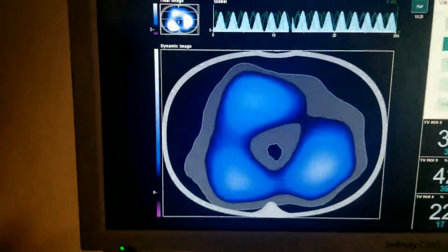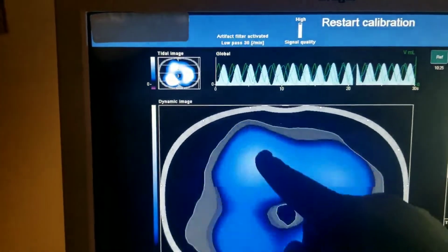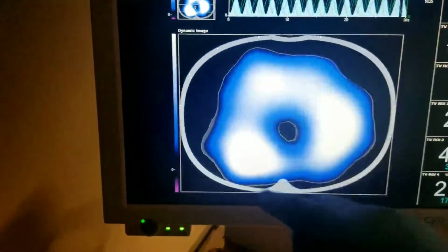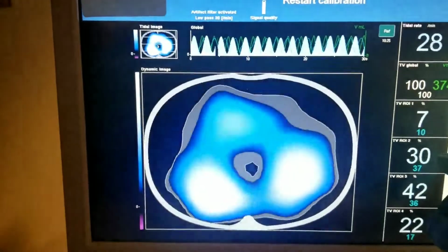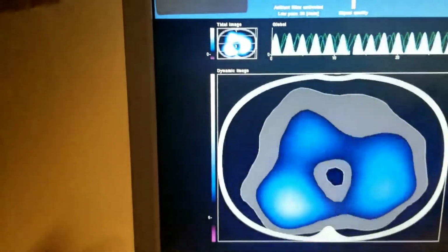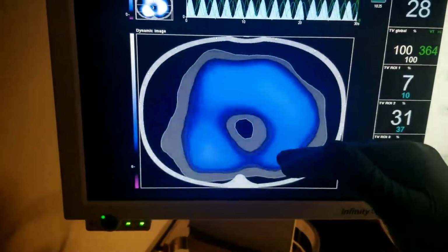Look at that white intensity. So it's forming at least a pretty decent circle. Seems now that there's a little bit of loss in this region, and now you kind of have three circles instead of this consistent white intensity here. So definitely some distribution of ventilation has changed. We've increased the dorsal region. We've dropped the ventral as well as mid-ventral. So it seems like it's slightly shifting down towards the mid-dorsal and dorsal region. So there's been a shift in ventilation in this respect.